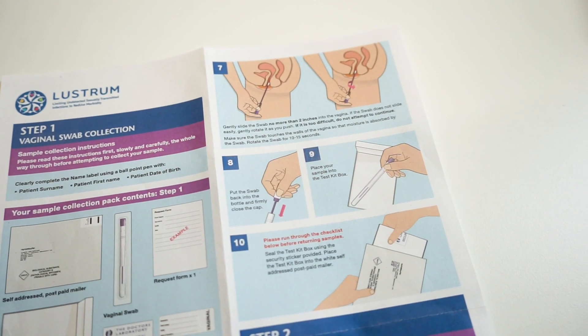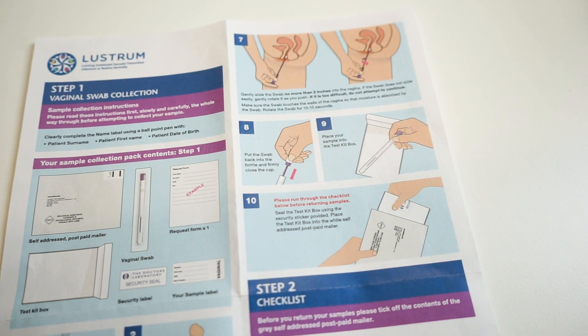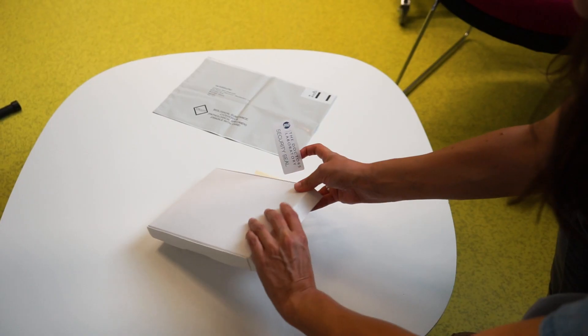Make sure the swab touches the walls of your vagina so that moisture is absorbed by the swab. Rotate the swab for 10 to 15 seconds. Put the swab back into the bottle and firmly close the cap.